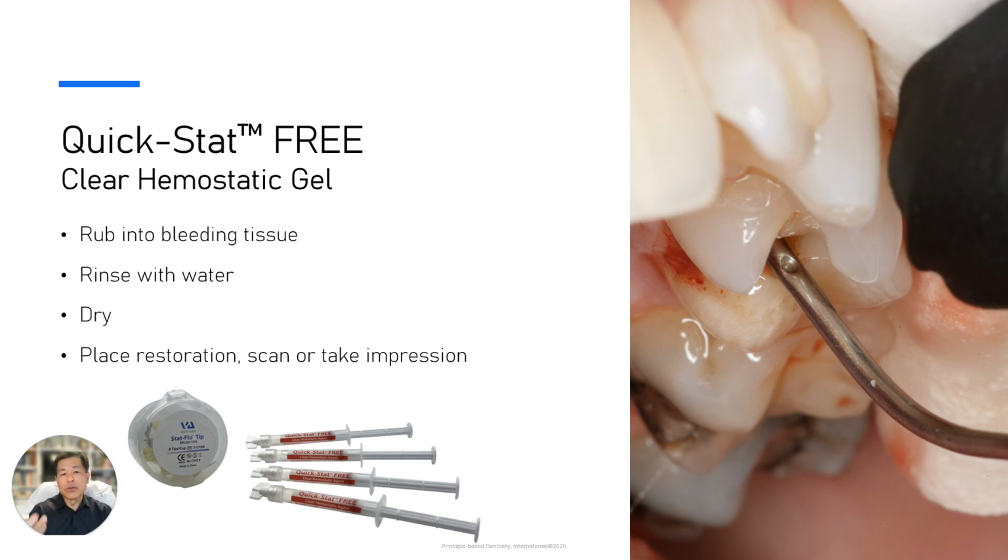So as I'm removing the old filling and the decay, the gum's bleeding a little bit. So I'm just going to apply this medication to stop the bleeding. It may not taste good, but I will tell you, I really haven't had patients complain about the taste, and I rinse it out and I dry it.